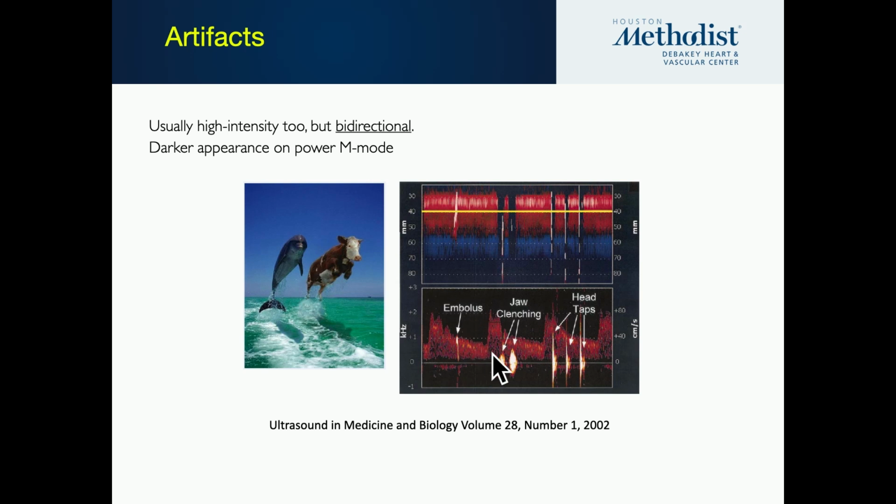And again, those are just sitting on the zero line when you tap the probe or you move the jaw, some muscle movement creating that. And what you need to see is that it's multiple depths at the same time. So that's why it's a straight line. So it's not traveling, zero speed. This is why it's sitting on a zero line on the spectrum.